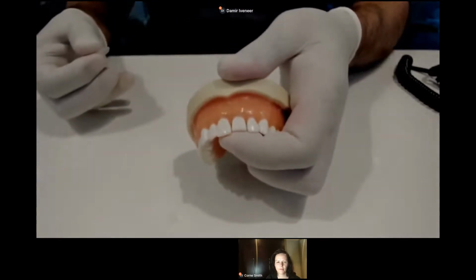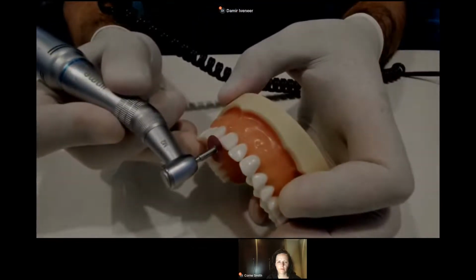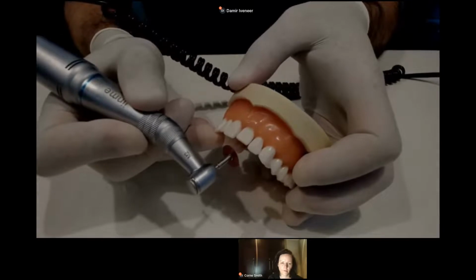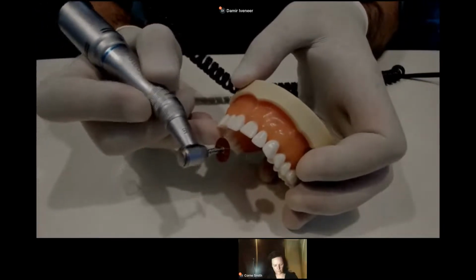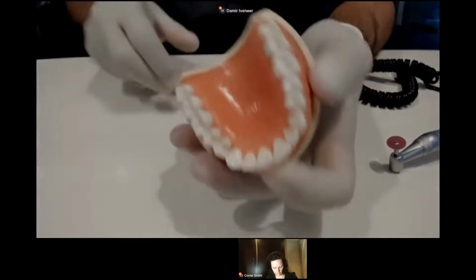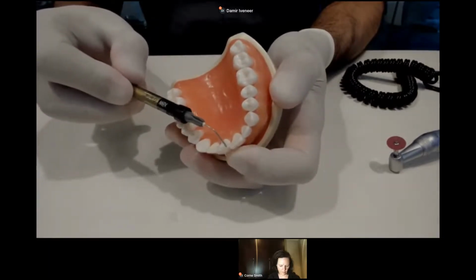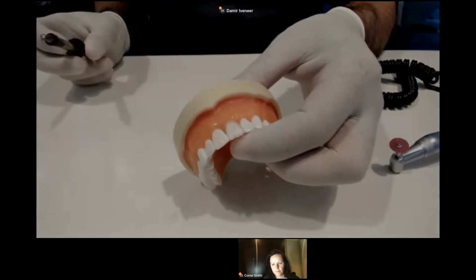First, we build a palatal shell, we cure it, we make sure that it doesn't touch the adjacent teeth, we work with the disc to have the exact height like the adjacent teeth, and it is better to reduce 0.1, 0.2 millimeter less than the adjacent teeth, so we can put again the matrix, sit it all the way down under the gums, and afterwards we check again if there is a very small opening left, we can close it with a freehand flowable, cure it, we fix it while we cure it, and then we inject the whole material again.